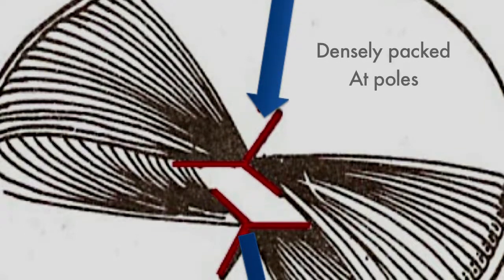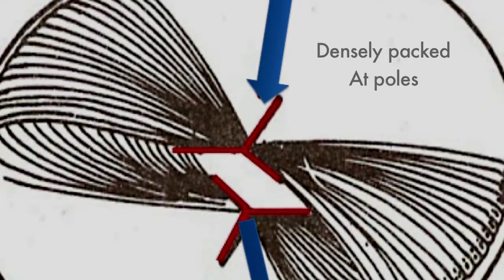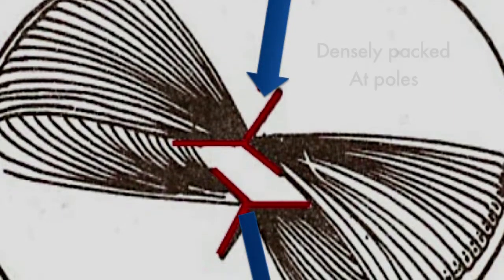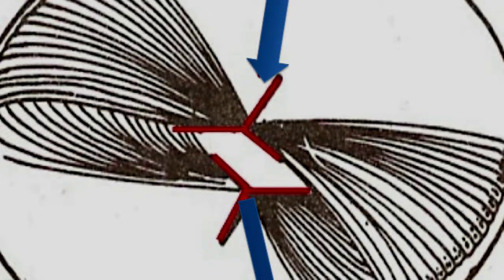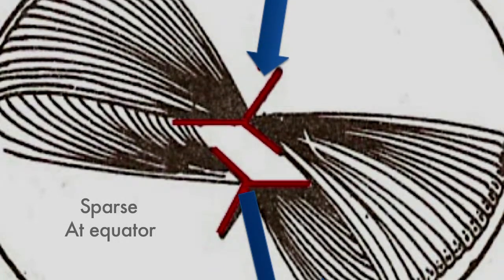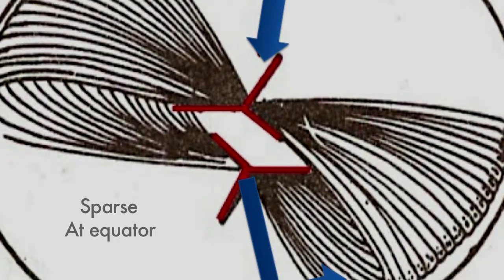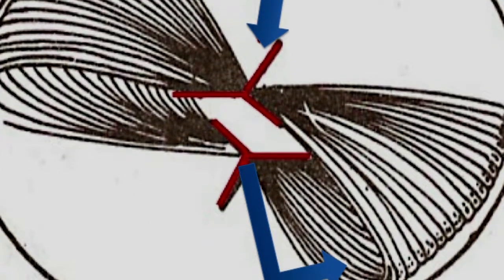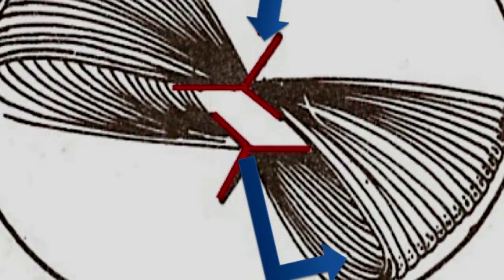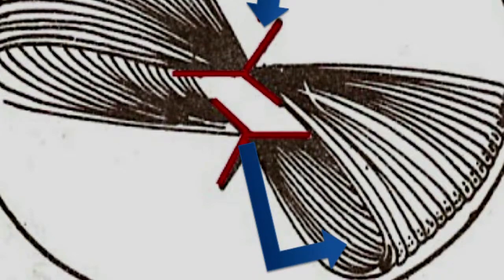Fibers are very densely packed at the poles, making the nucleus very bulky, hard, leathery and unbreakable at the center. But while passing through the equator, these fibers are sparsely arranged, making the nucleus very weak, thin and soft, with a wide cleavage plane at the equator. Hence, it's always easy to achieve a natural cleavage plane between the lens fibers and initiate the tear at the equator rather than penetrating deep into the center of the nucleus.